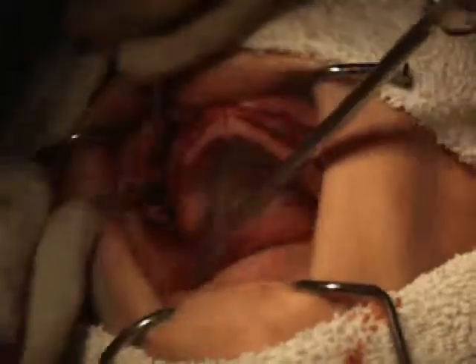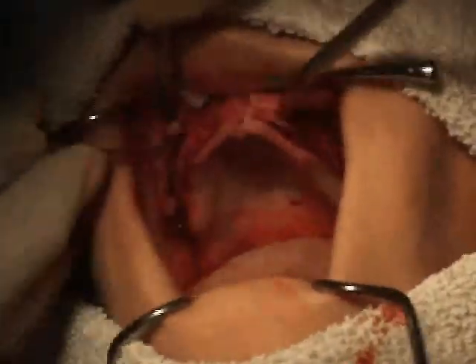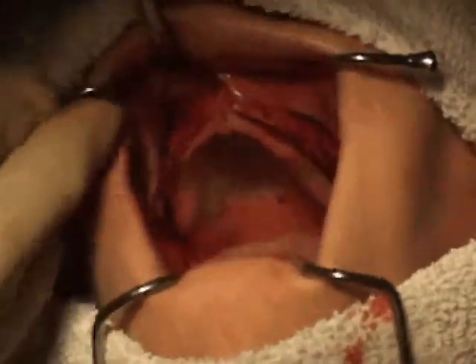We'd like to get the periosteum off the bone as clean as we can so that the membrane isn't damaged, because we're going to be using some of the cells on that membrane to begin to grow bone between the alveolar ridge and the periosteum.